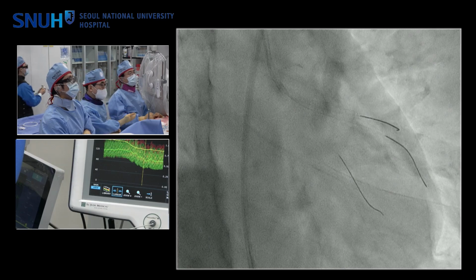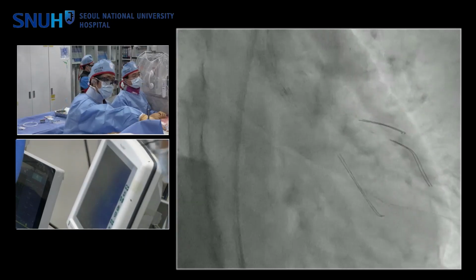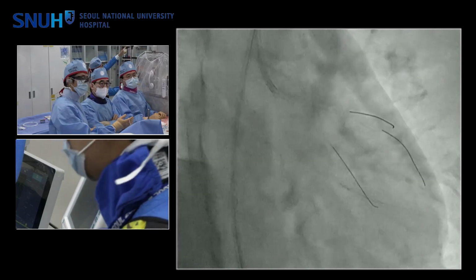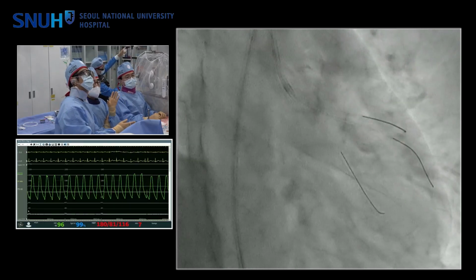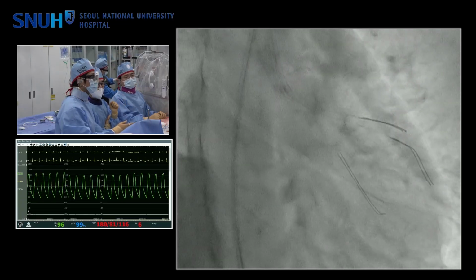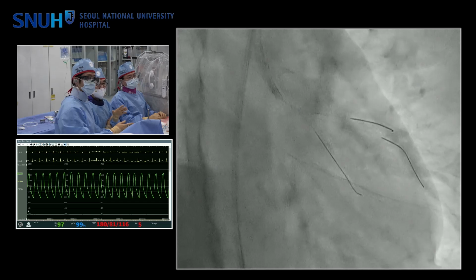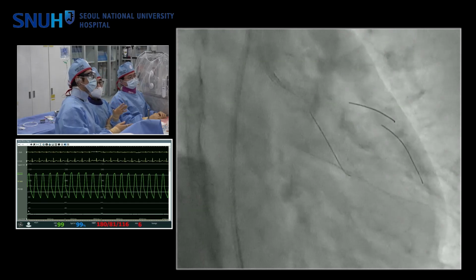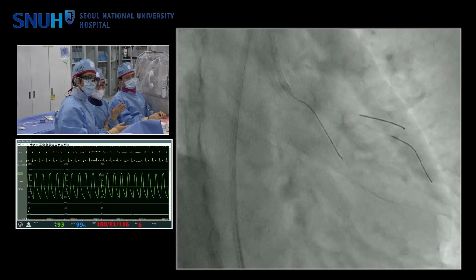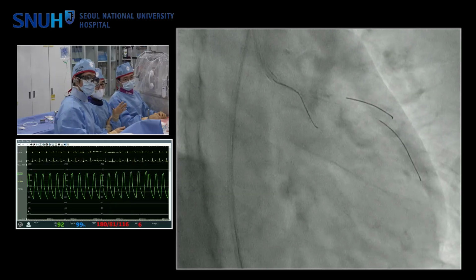Okay, just pull back. Invasive FFR pullback. 라이브로 바꿔주세요. 레코딩 해주세요. I'm going to pull back now. Can we see the 85 pressure? 86. Then we are going to pull back the invasive FFR pressure wire. Now 85. We can see 85, the aorta pressure. 86. 85. 90. 95. We need a 96. 99. 100.